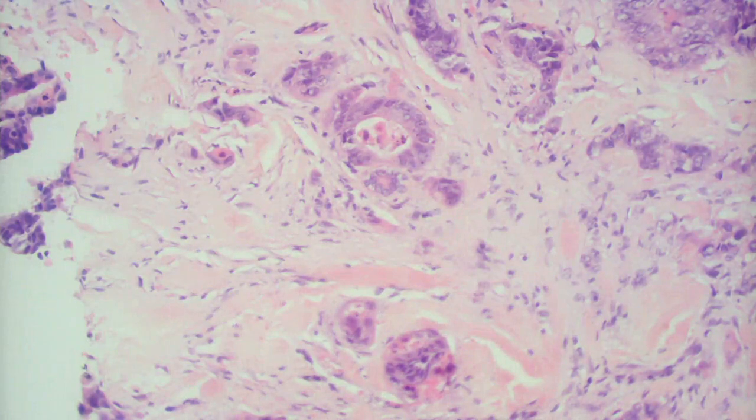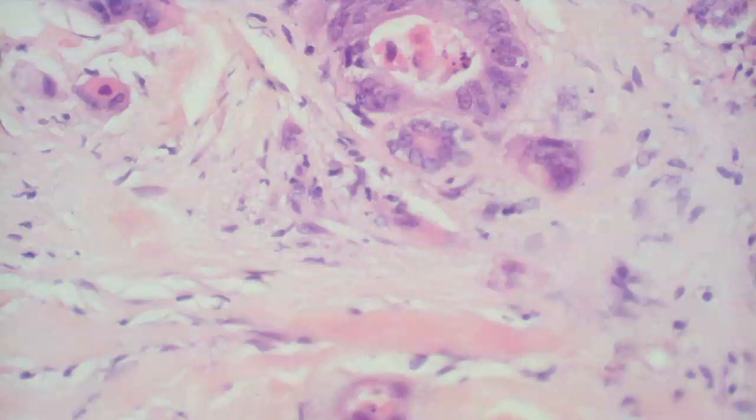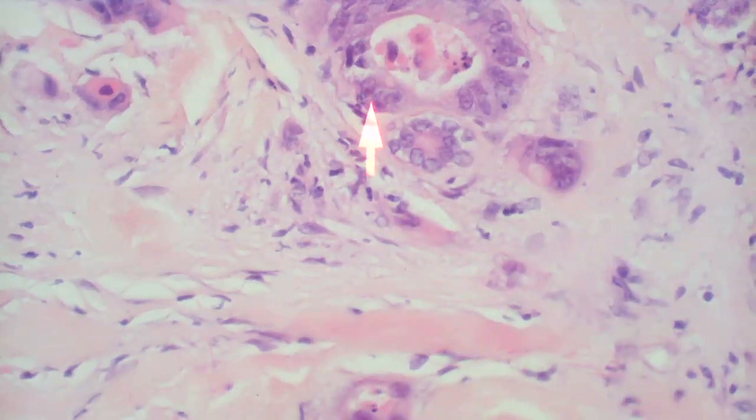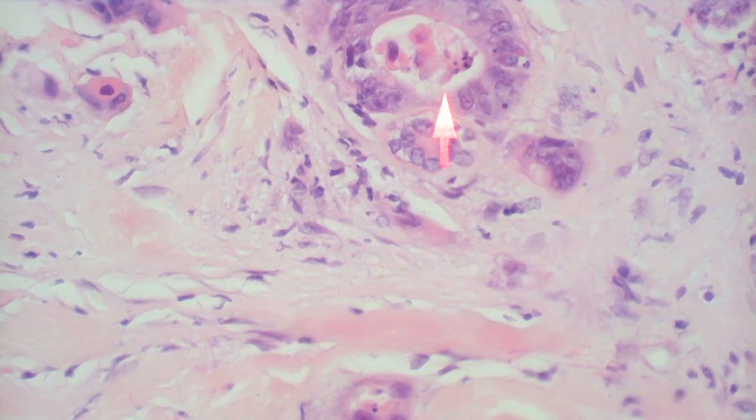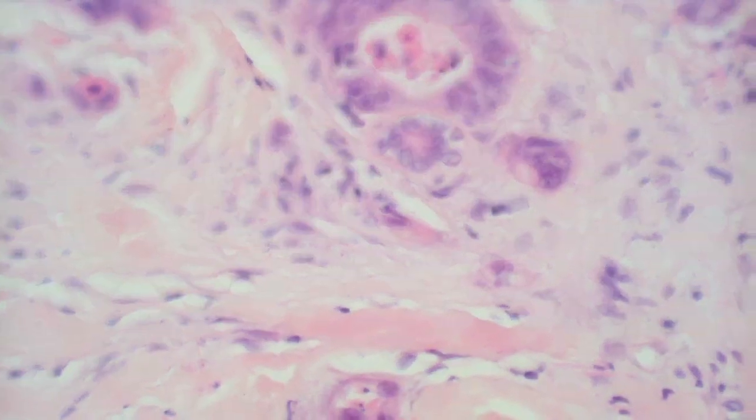You probably wouldn't necessarily, again, they're not going to ask you a lot for that. But if you could pick out the fact that it's probably a metastatic lesion, it's an adenocarcinoma gland here. And here's that dirty central necrosis. It's a really nice example of that. So colon cancer doesn't metastasize all that commonly, but it does.